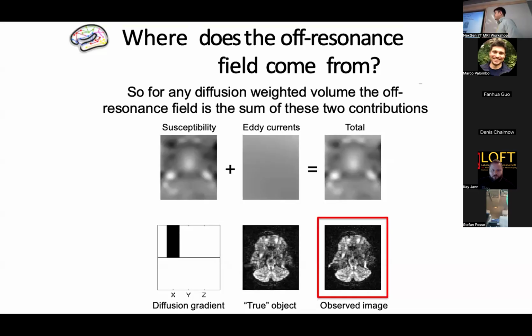Okay, before I get into the last two, I want to give a quick overview, just a couple of slides, of what the distortion correction methods are and why they're needed for diffusion. A lot of people here at least know fMRI, I would assume. On the left, I'm showing susceptibility-induced B0 inhomogeneity. Everyone knows about that; the top-up method was talked about. But it turns out eddy currents can also cause distortion, and the field inhomogeneities they create add together with the standard B0 inhomogeneities, giving you a total field distortion. I wanted to show a few slides of why correcting for eddy currents is important and give you a sense of where they come from.